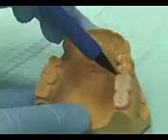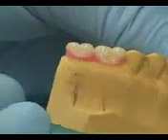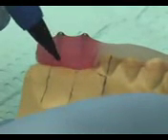Many times to determine the location of the implants in the posterior area, we may do a diagnostic setup. In this case, we set a couple denture teeth in the area where the teeth were missing in the posterior. So having determined the location of our implants, we went ahead and with another blocked out model, we made a radiographic guide. Note how the buccal aspect of the radiographic guide has been contoured to simulate where we would like the final gingival margin on our restorations to end up.